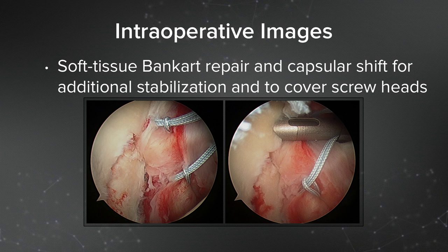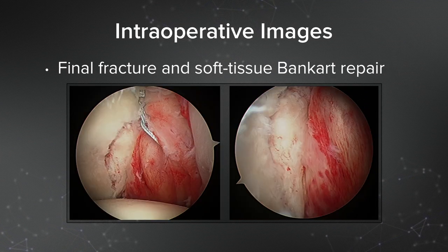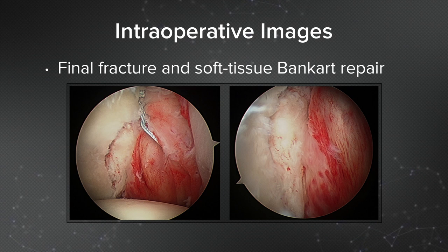You can see two racking stitch sutures placed to cover the screw heads. Here is the drilling of the pilot hole for the push locks. Here is the final fracture and soft tissue Bankart repair — it's an anatomic reduction with no screw head prominence, and the capsule and labrum have been shifted.